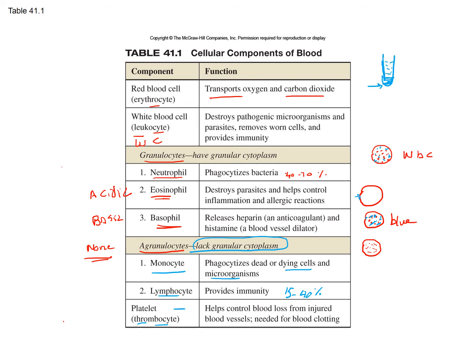Okay, so when you first go to the doctor, again, you get the blood analysis. You take a little bit of the blood sample, put it inside the tube, and put the tube inside something called a centrifuge to separate the blood components.